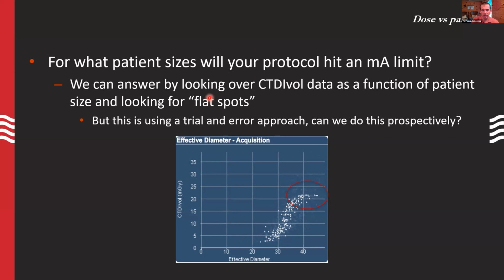So it's really important, I think, to be looking for these kinds of flat spots when you're trying to do this protocol optimization. All right, but that's kind of like experimenting on our patient population. We don't really want to do that. Can we do this in a prospective manner?